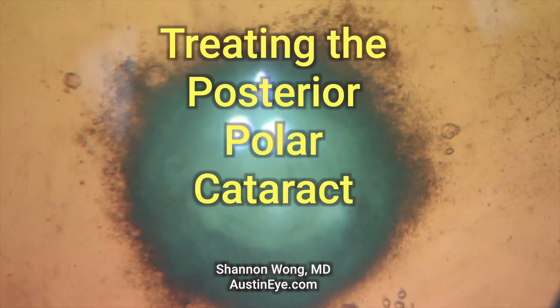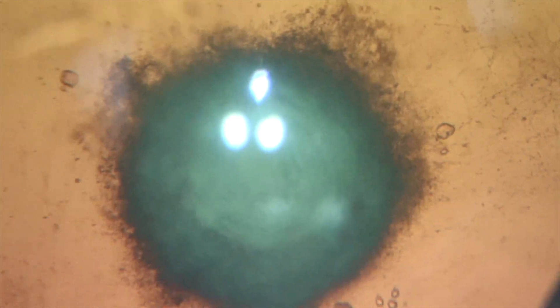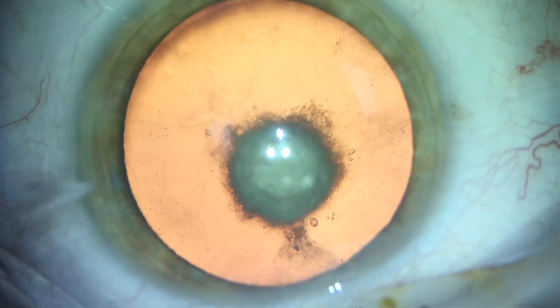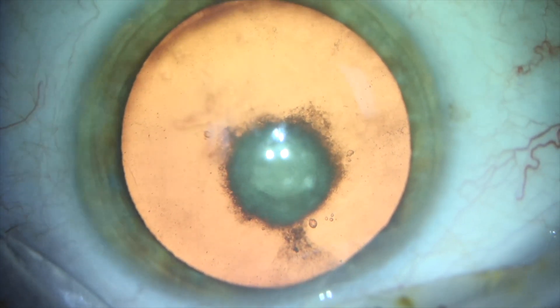Here we are about to treat a posterior polar cataract. These types of cataracts are characterized by a dense posterior capsular plaque that is often associated with a weakness in the posterior capsule in the visual axis. Many published reports show that there is a one in three chance of this patient having a posterior capsule rupture during cataract surgery.